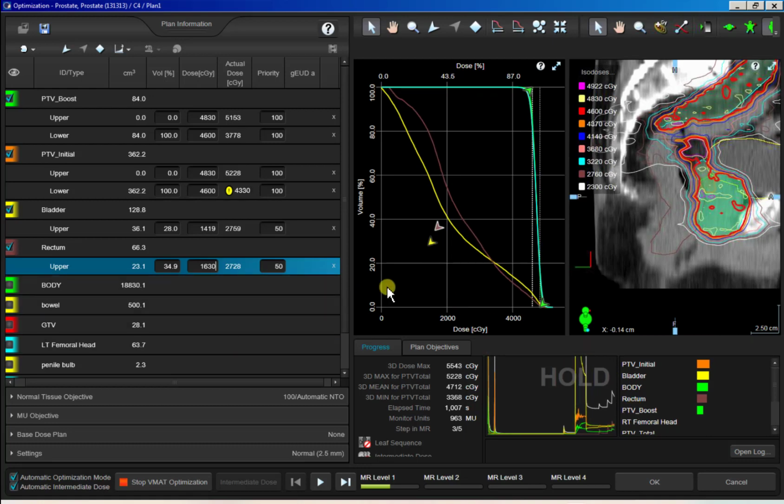For this video demo, I'm going to go a little quicker than that. But the more patient you are, the better the plan will come out. And again, it's part of the learning process. How patient should you be? When should you be patient? All that type of stuff.